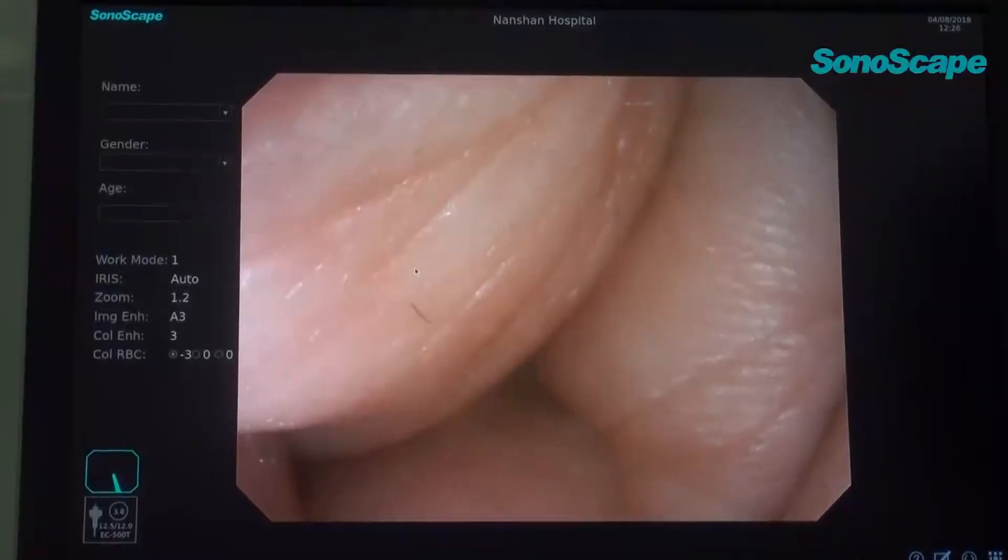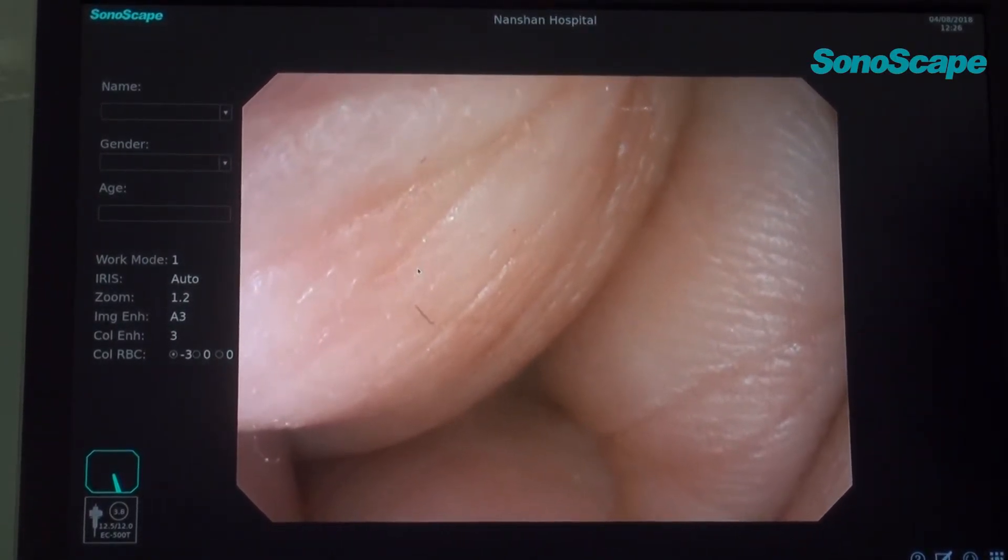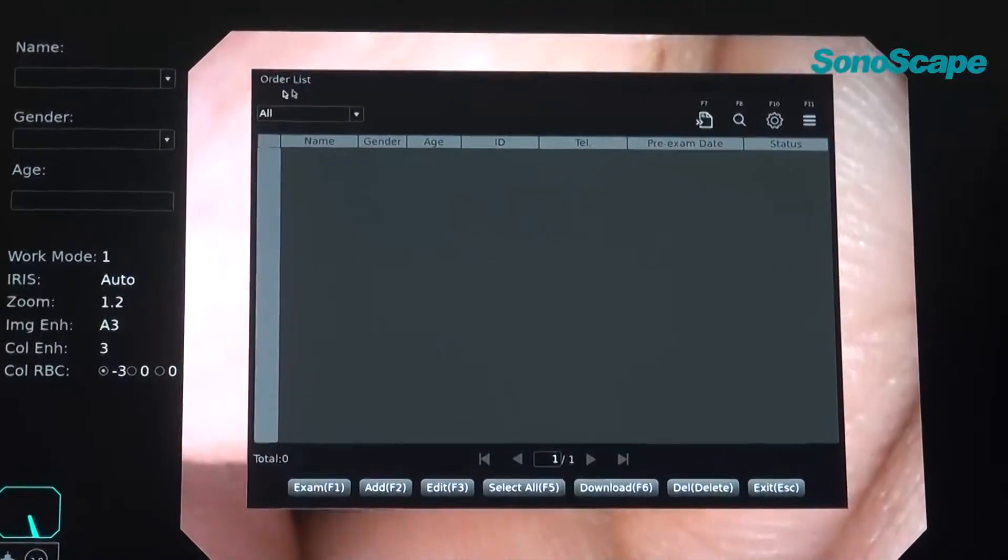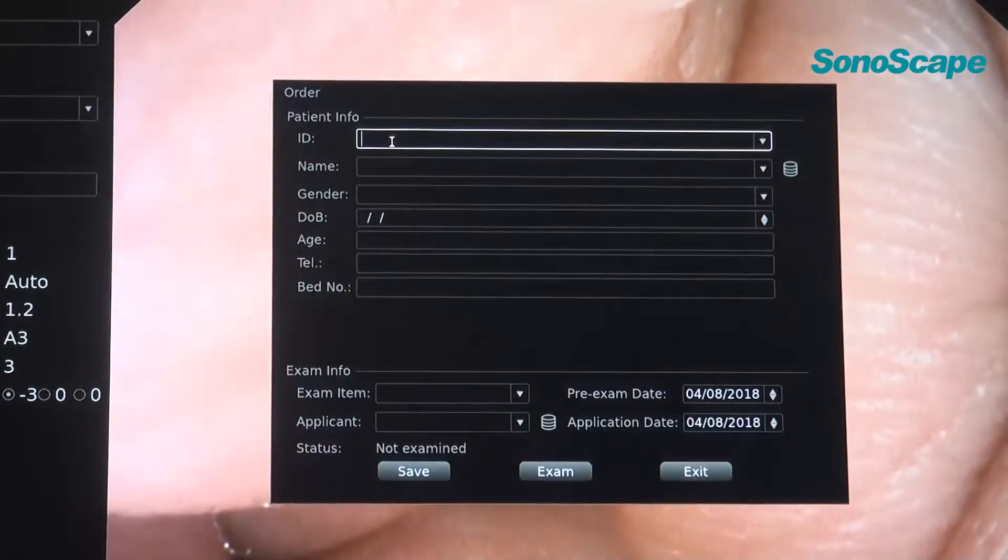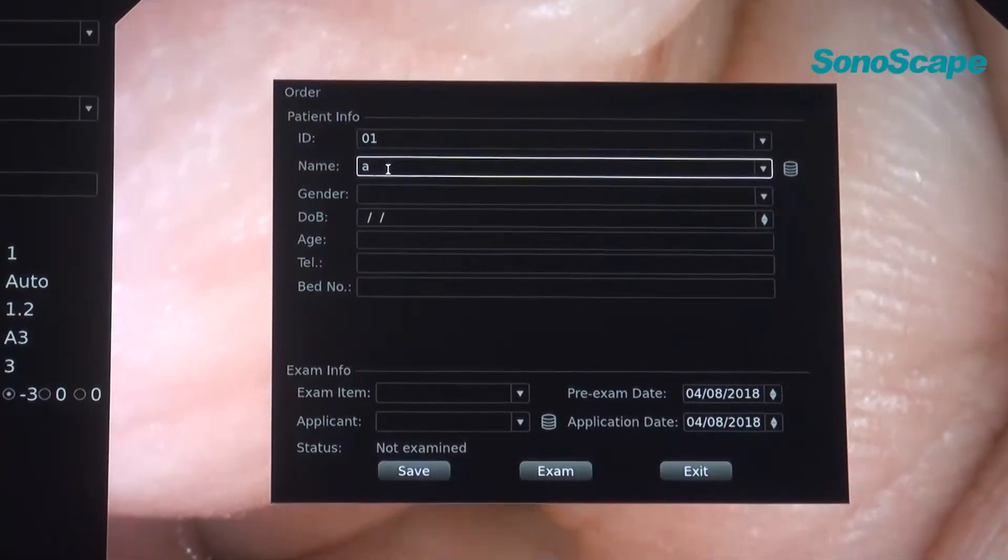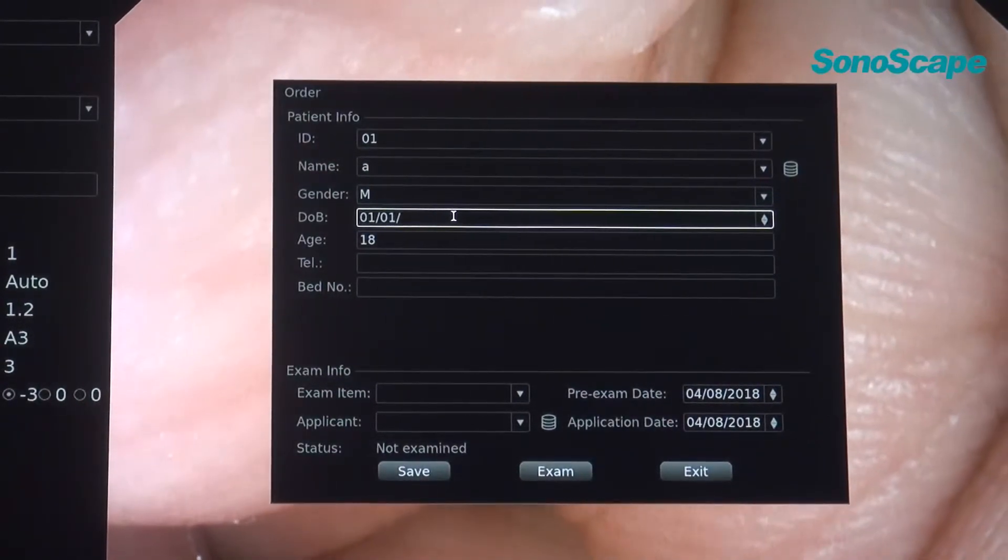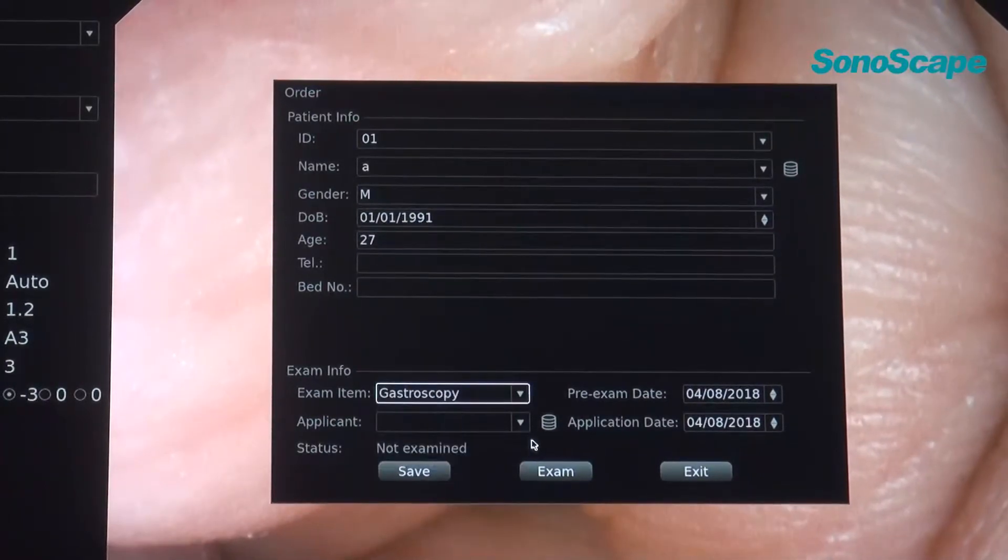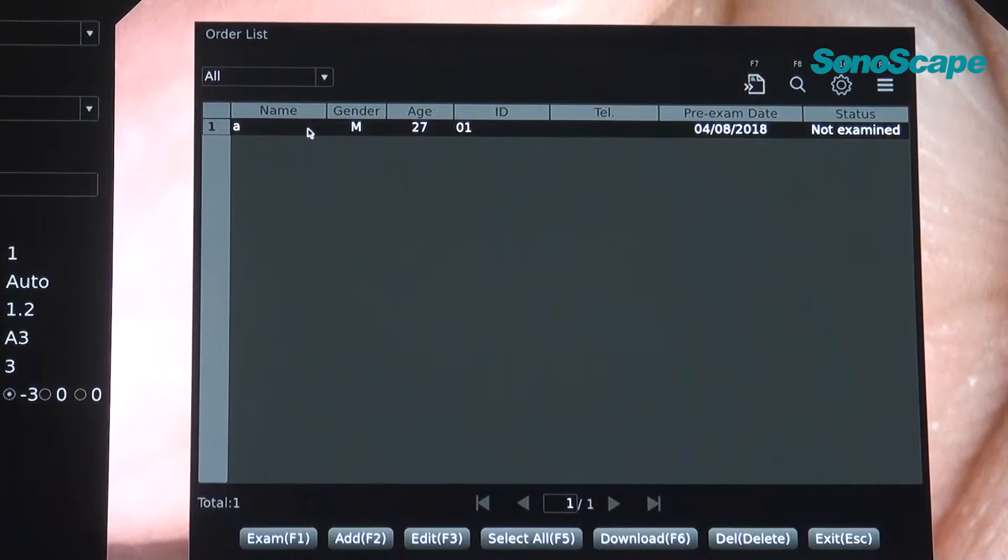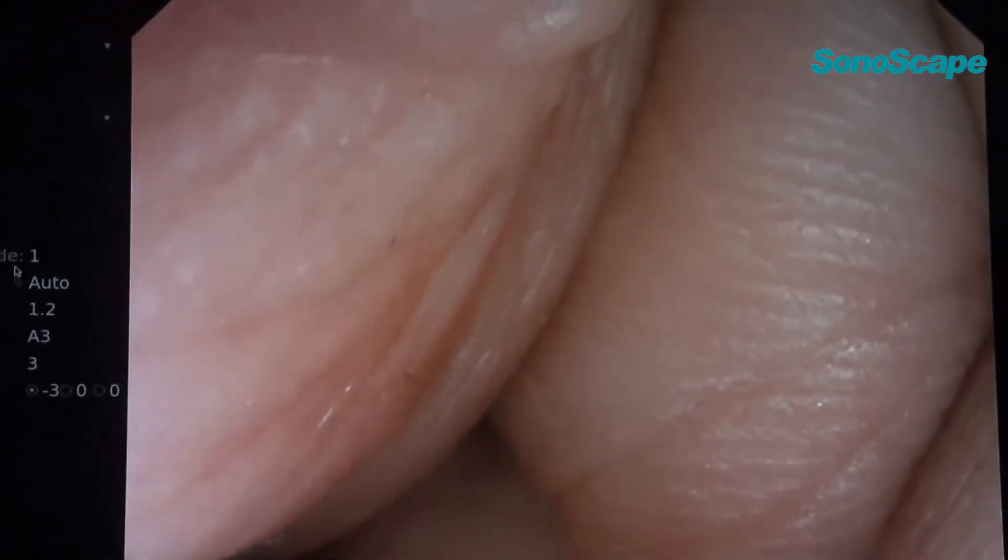And now, we come to how to make order list. And how to edit and print the report. First of all, press F3 on the keyboard. We come to the order list. This list is for the patients who make appointment with the doctors and to be examined. Add information of the patient. You can make ID as you wish. And make the name. And then select the gender. Date. Date of the birth. You can enter in the number. And the age was automatically calculated. Exam term. And applicant. So you save it. You will find in this order list. This patient. The information has already been saved. You double click the right side of the mouse. The patient information was showed in left side of the interface.